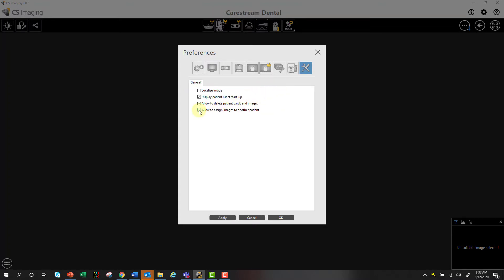Allowing images to be assigned to another patient. This is really only used with standalone. In other words, if you're connecting through a practice management software, you won't have the option to move patients in this fashion. I'll cover a localized image at another time.